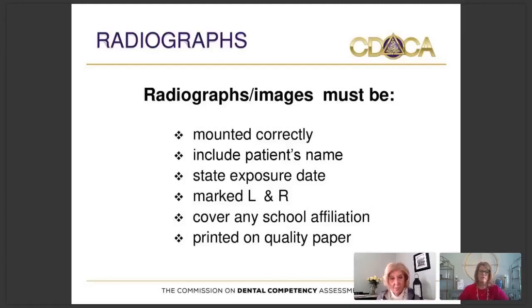They have to be marked with left and right. And if there's anything on the radiographs that has your school affiliation or your name or anything that would identify you, please make sure that they're covered. Remember, this is an anonymous exam. You don't sign any of the paperwork till after the exam to maintain that anonymity, and we want it on the radiographs too. So if there's any school affiliation or anything that would identify you, please cover it.